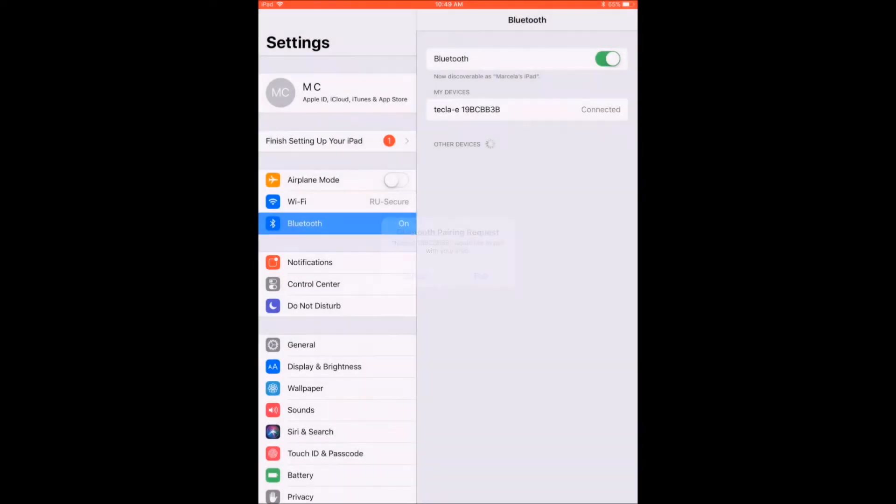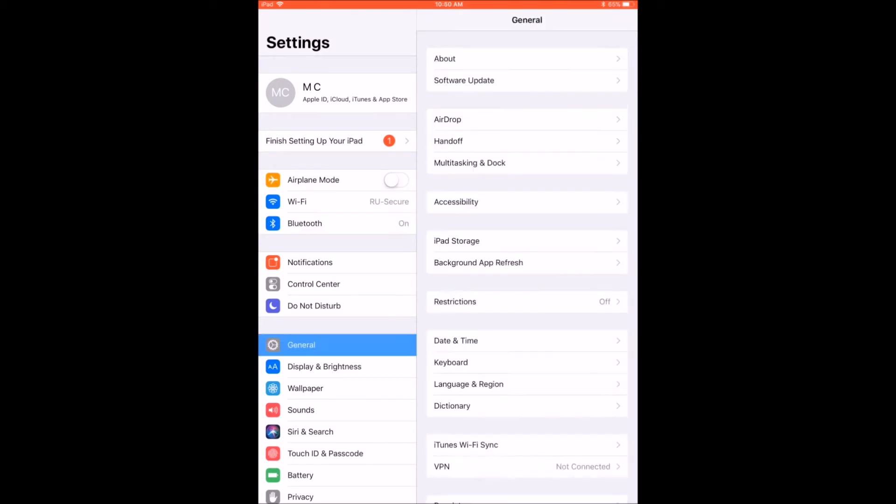After a few seconds, Tecla-E should be under Paired Devices and appear as connected. Once Tecla-E is paired, you can proceed to the next step.